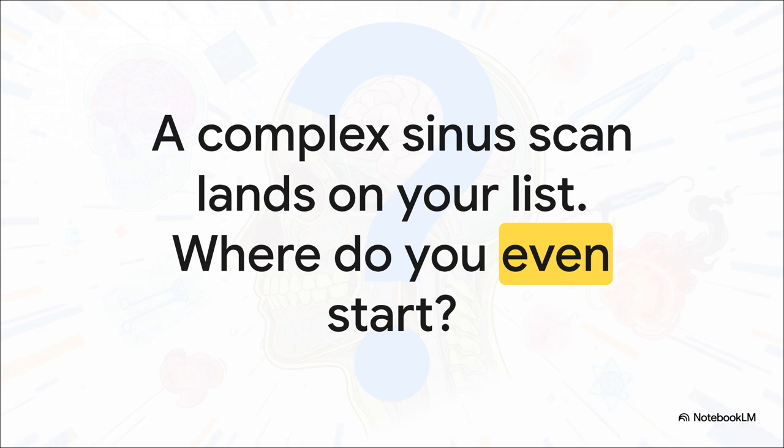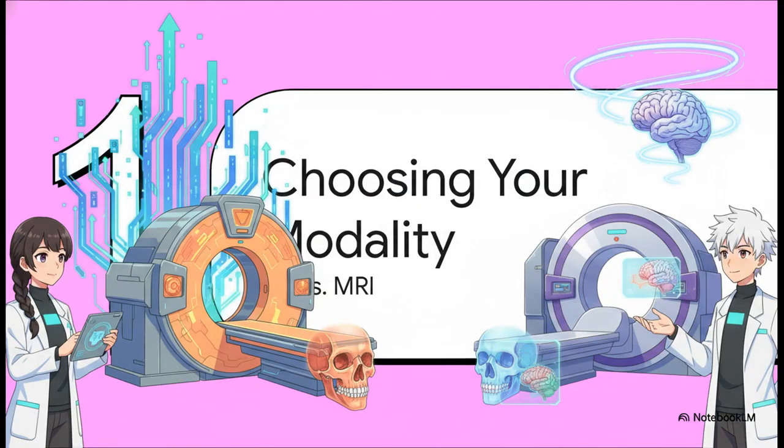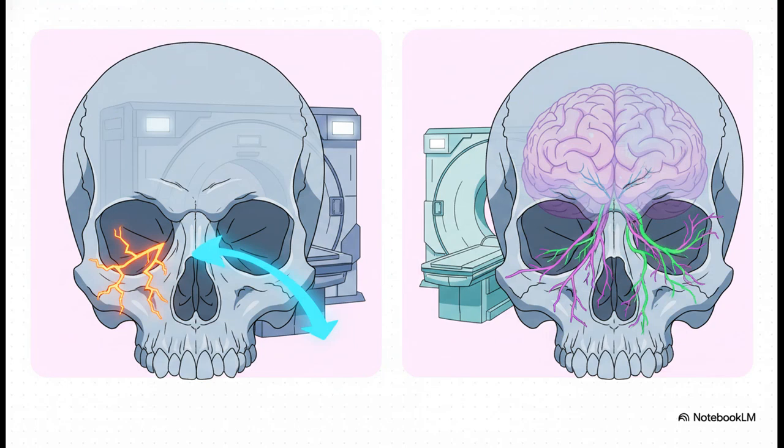Okay, first things first, your most important tool, before you even think about a diagnosis, is picking the right study for the question you're trying to answer. The whole CT versus MRI decision, it's not random. It's absolutely fundamental. So here's the bottom line, and you really want to burn this into your brain.